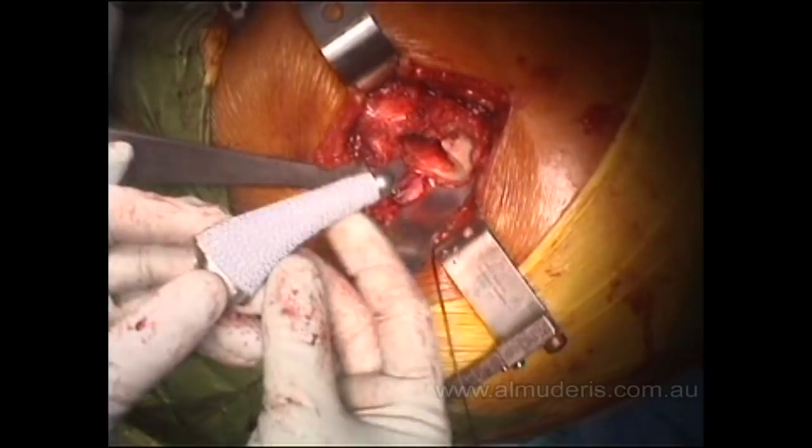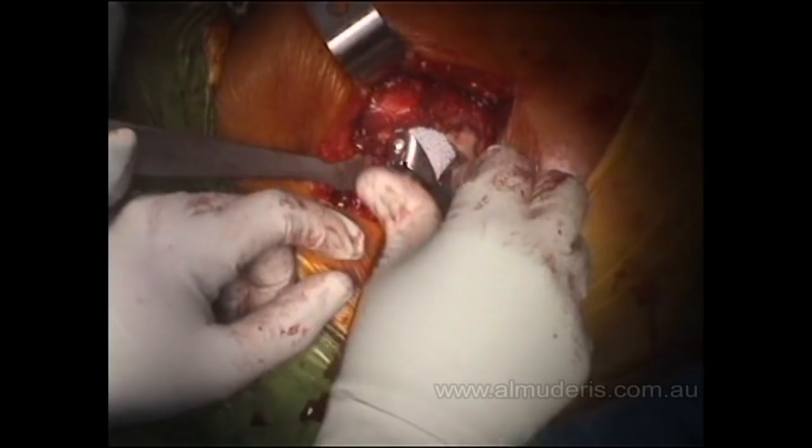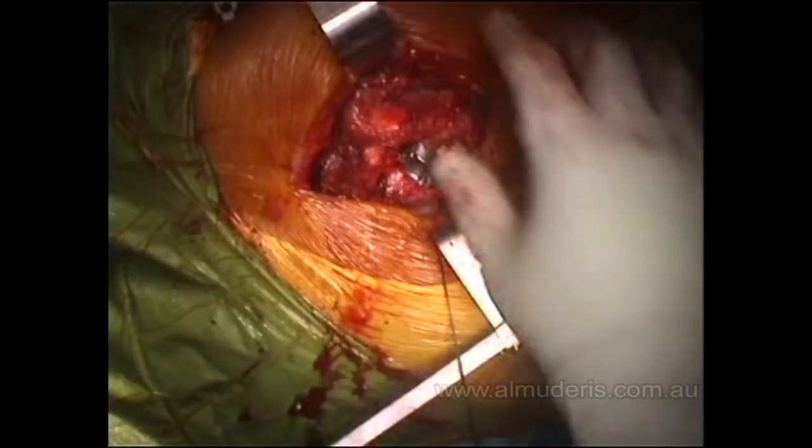The implant is short and it is covered with spongy metal and hydroxyapatite to become as biological as possible and ensure bone ingrowth. The implant is gently inserted and then the leg is repositioned.